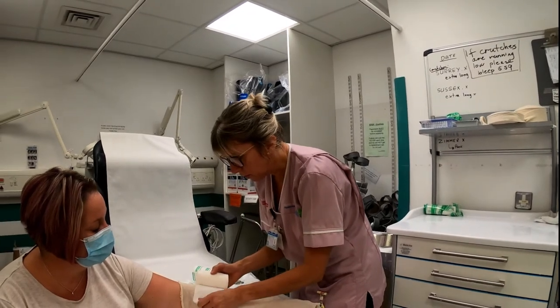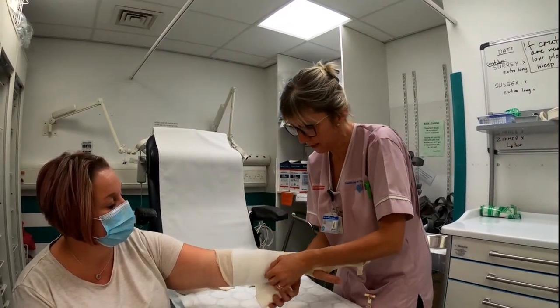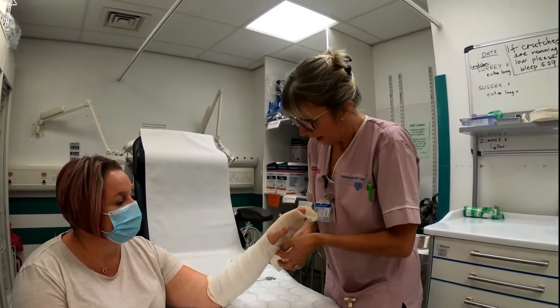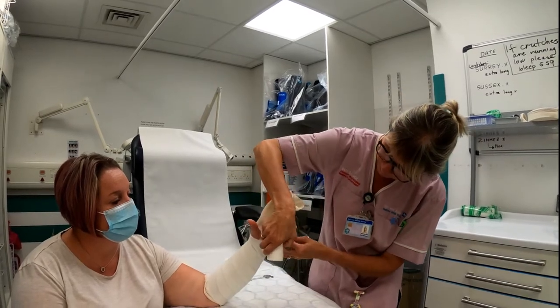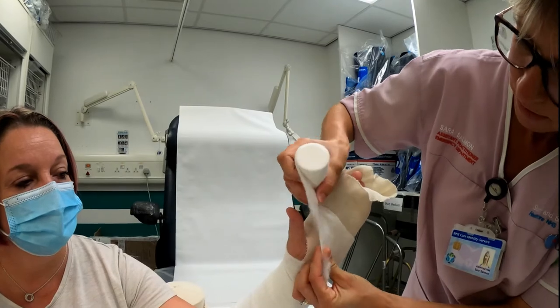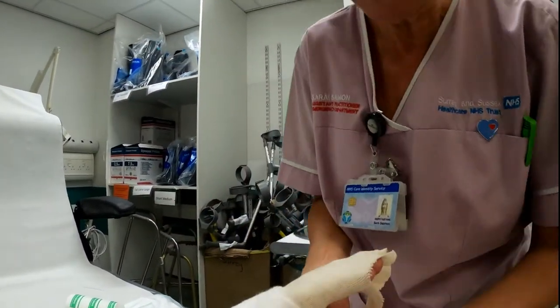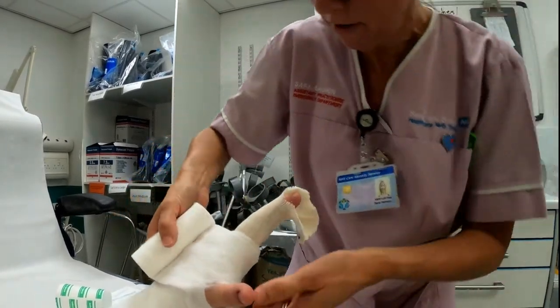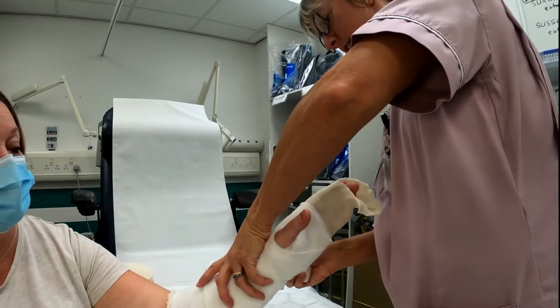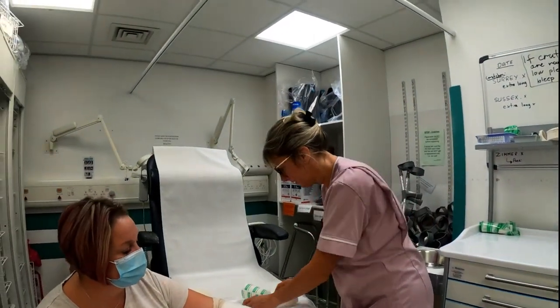Right near the elbow crease, do two layers, then drop it by 50% so that every rotation has two layers, working your way down the arm. You can rest on your elbow for comfort. When you get round to the web space, you can't come all the way down without cutting it — so tear it to halfway across the soft band so it sits neatly, then it goes around the back across the knuckles. Do that twice, then come back up to tuck all loose ends in and tear it so it sits neatly without falling away.